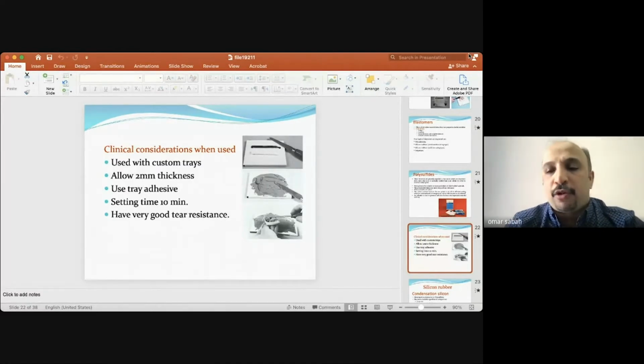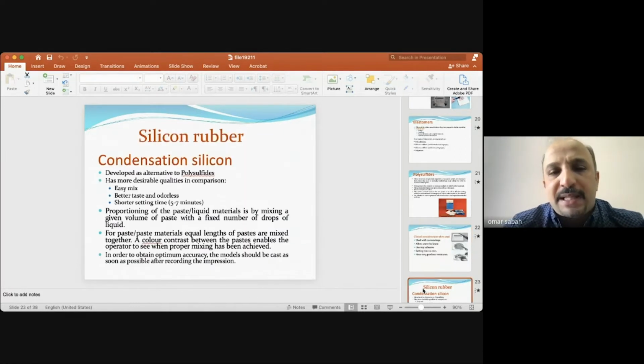Okay, so I am going to the most common type of material used, and maybe you see it with your friends in the fourth and fifth grades with patients: the silicone rubber material.